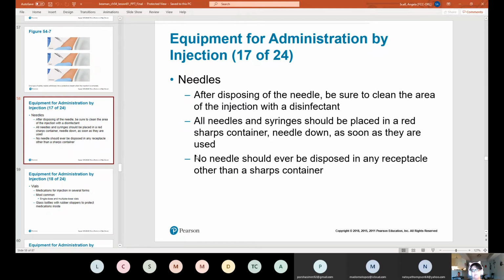I've come across people who say, oh my God, because I'll let the patient's blood trickle, because it's a vein, okay? And yeah, there might be some blood coming down the arm. I'd rather come back and clean up a little blood off my patient's arm than accidentally stick myself or someone else with a dirty needle.